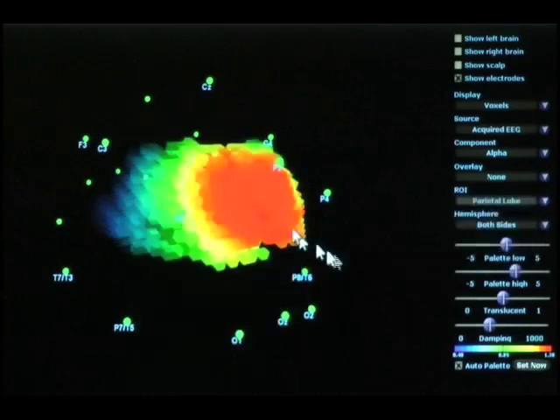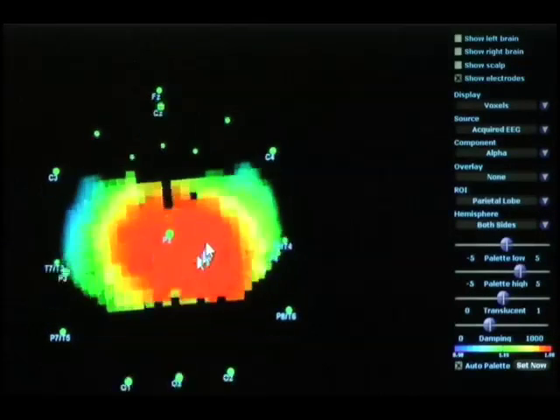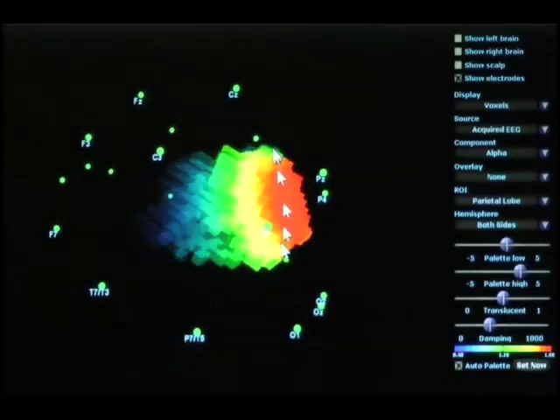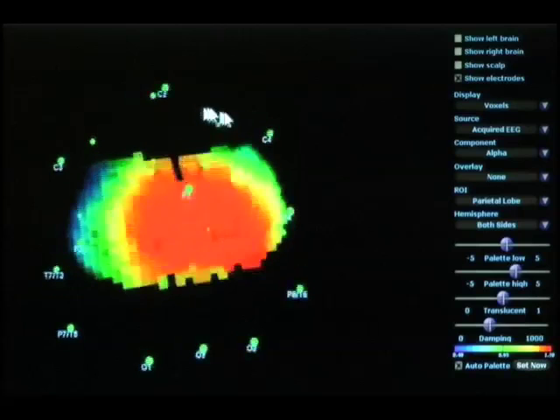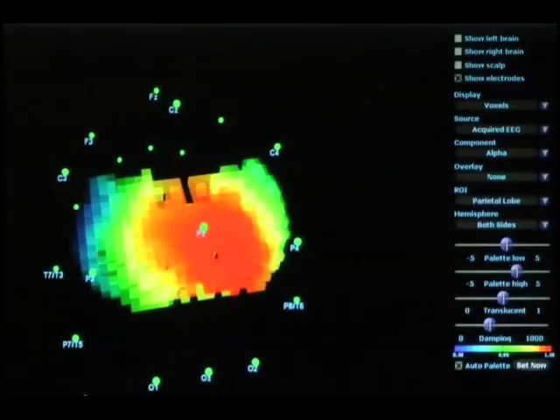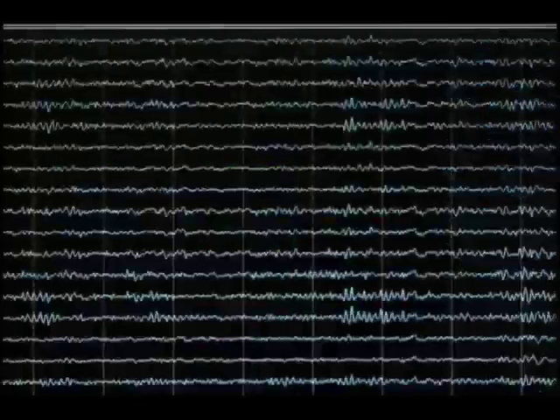The next choice is the parietal lobe, and we definitely see this is the location where that predominant alpha activity resides. It's in the mesial areas of the parietal lobe and it's a little larger on the right. This information would be visible on the raw EEG.